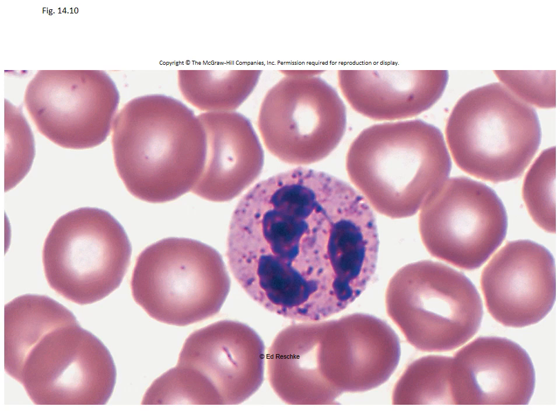Now, a neutrophil does have granules. You can see all these little dots here and there, and that is fine to kind of hone in on. But the key to the neutrophil is this weird shaped multi-lobed nucleus. The original name for a neutrophil was a polymorphonuclear cell, which everybody kind of gets all freaked out because of how long it is, but it's actually a really descriptive name. Poly means more than one, morph means weird shaped, nuclear means nucleus. So it meant that there were more than one weird shaped lobe of the nucleus.